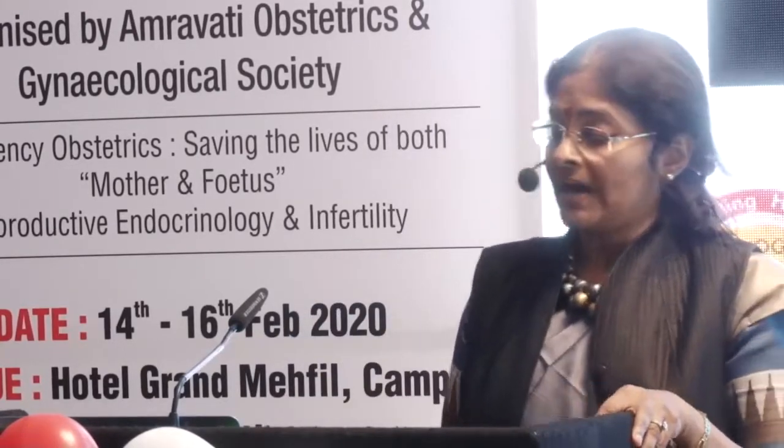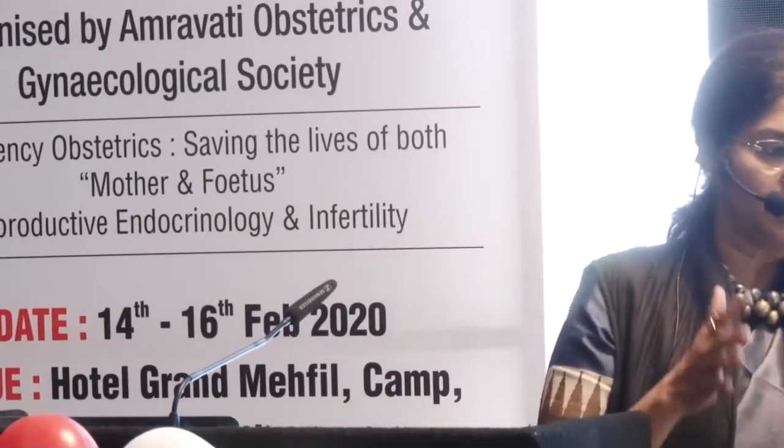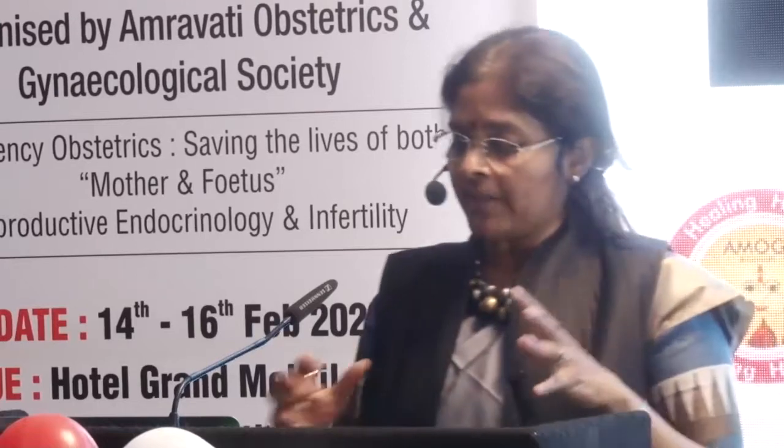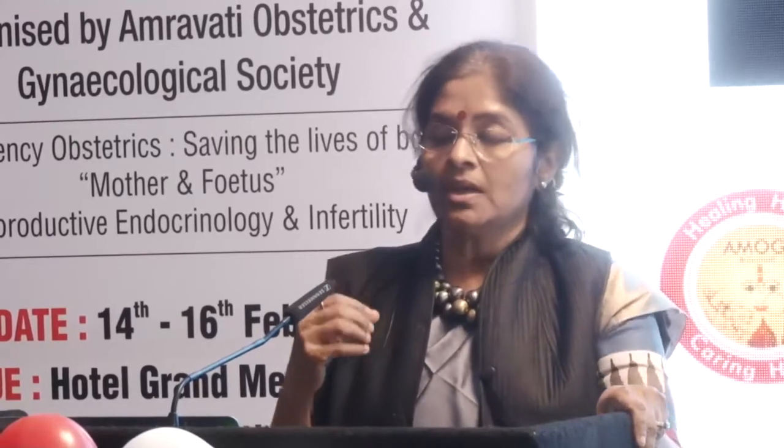scan. The rationale for such screening would be the detection of clinical conditions which place the fetus or the mother at high risk, which would not necessarily have been detected by other means of clinical examination, and subsequent management which would improve the perinatal outcome. So if we are going to do a third trimester scan, it must be because it will, like he said, improve either the maternal outcome or the fetal outcome, and not just as a replacement of the clinical evaluation. The other side of the coin is that doing a routine scan in the third trimester increases the rate of cesarean sections slightly. We must keep that in mind.